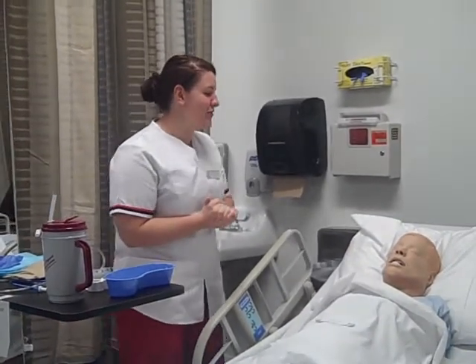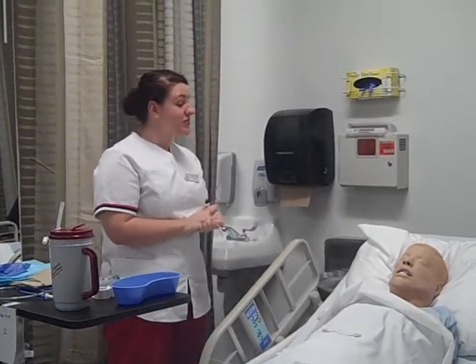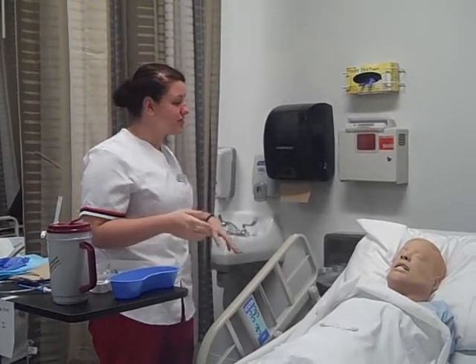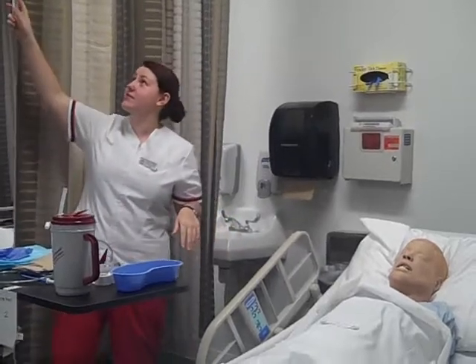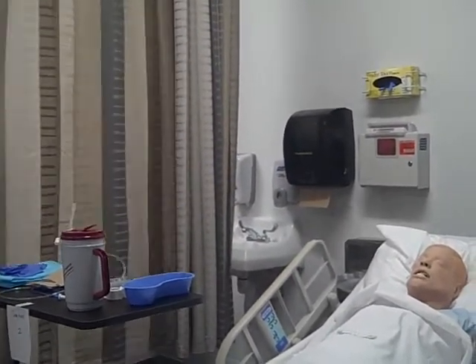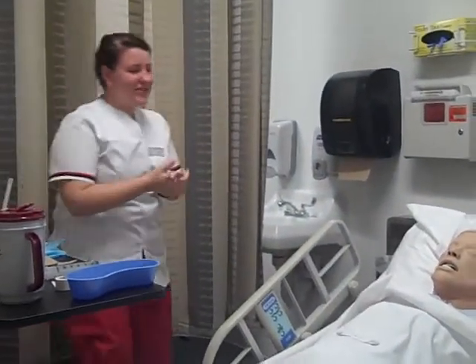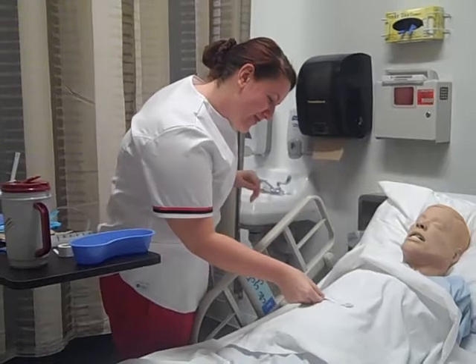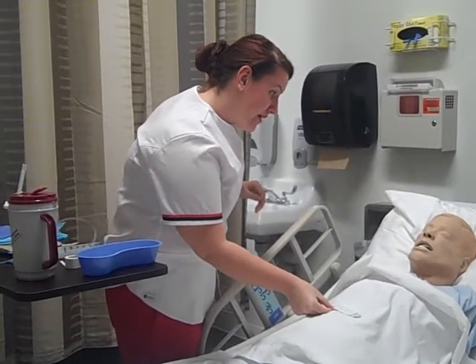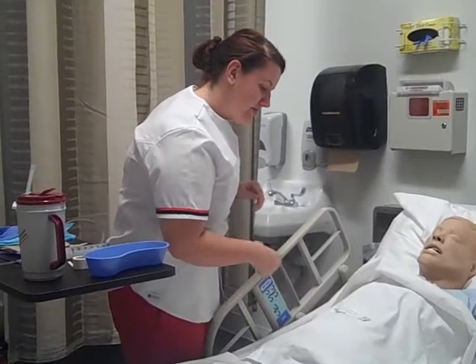Hi, my name is Shelby, and I'm going to be your student nurse today. I'm here to place your NG tube. Before we get started, I'm just going to close the curtain for you for your privacy. Can you tell me your name and your date of birth for me? And do you have any allergies that I need to be aware of? No allergies? Perfect.